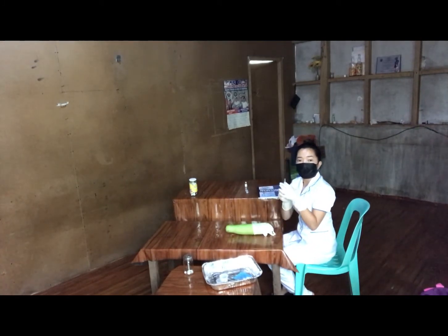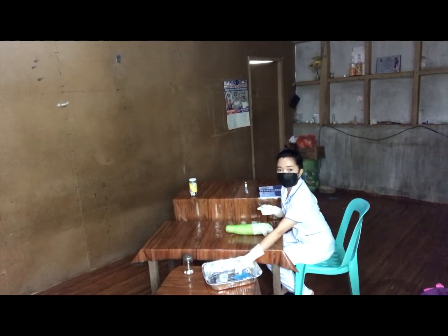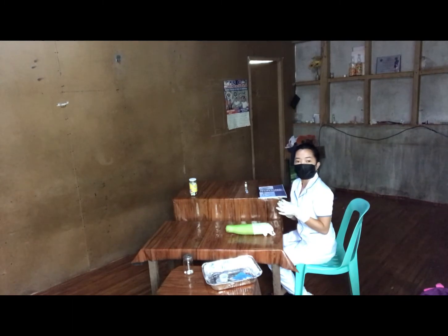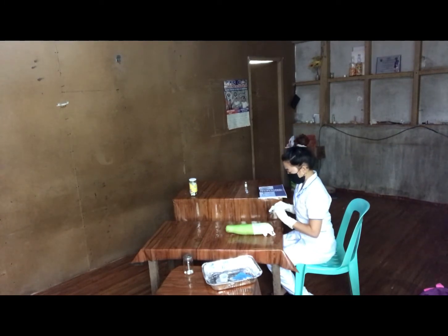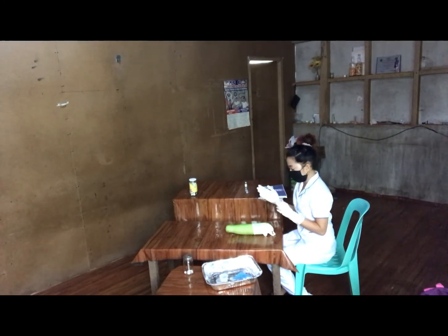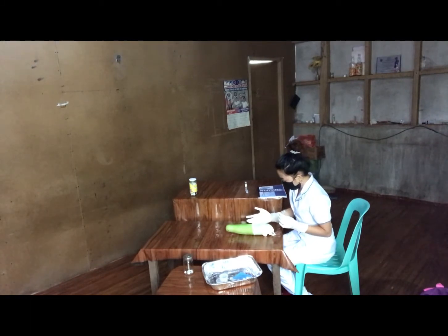And now remove the cap. This is the cap and I will remove this. And next we're going to take the non-dominant hand and we are just going to the side. This is my hand and I'm going to set aside this hand where the injection site is going to be, and we're just going to put a little bit of pressure and pull the skin to the side. So I will get the pressure of this.